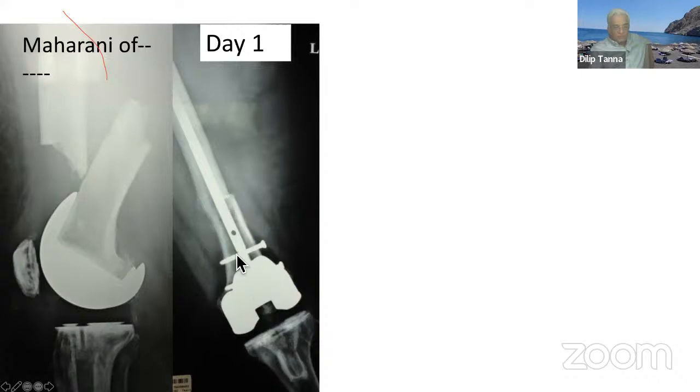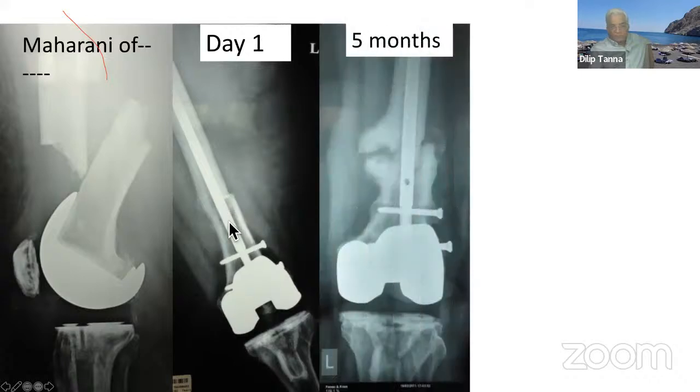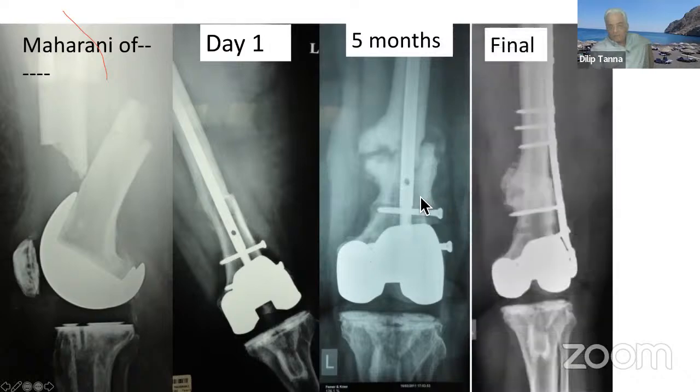As you can see here, this is the poor construct, and you can see what happened. Because of the mobility, this went into hypertrophic non-union. So I went down, used the same bone graft, which I had taken out, did the plating on the lateral side, and this has completely healed up.